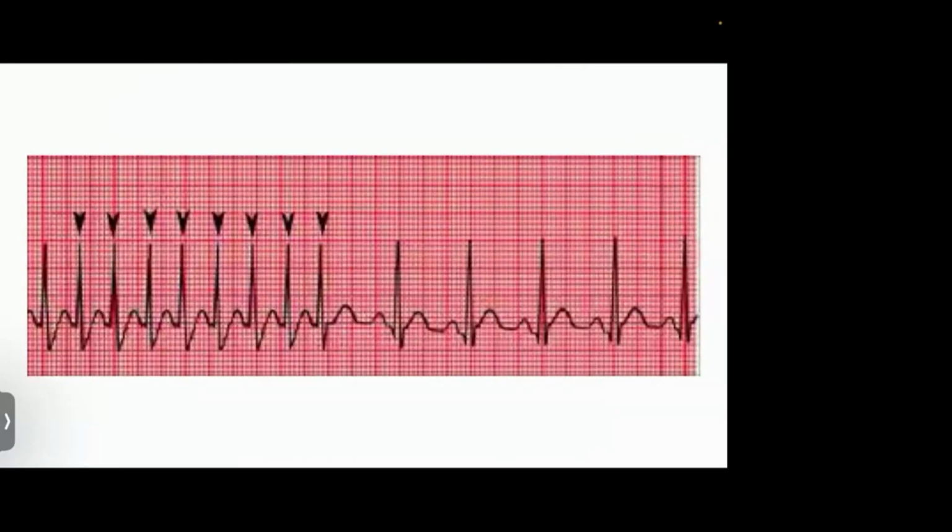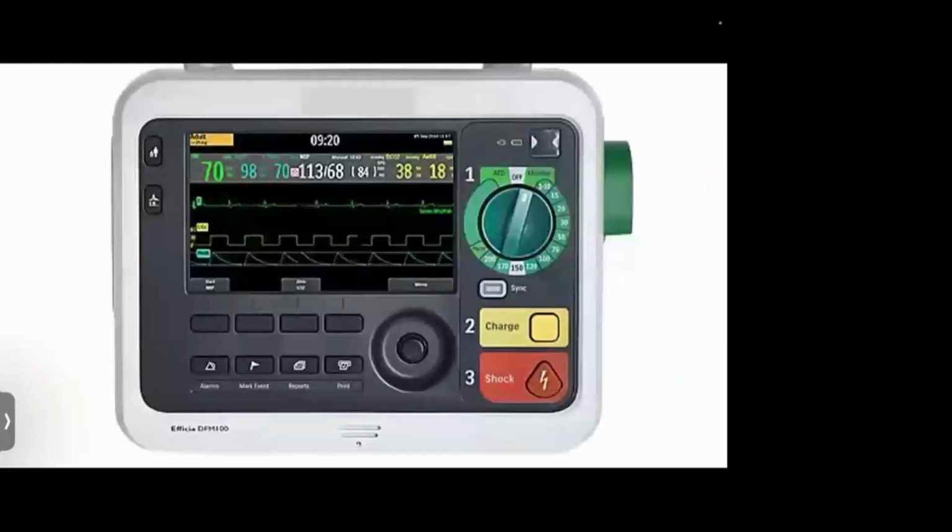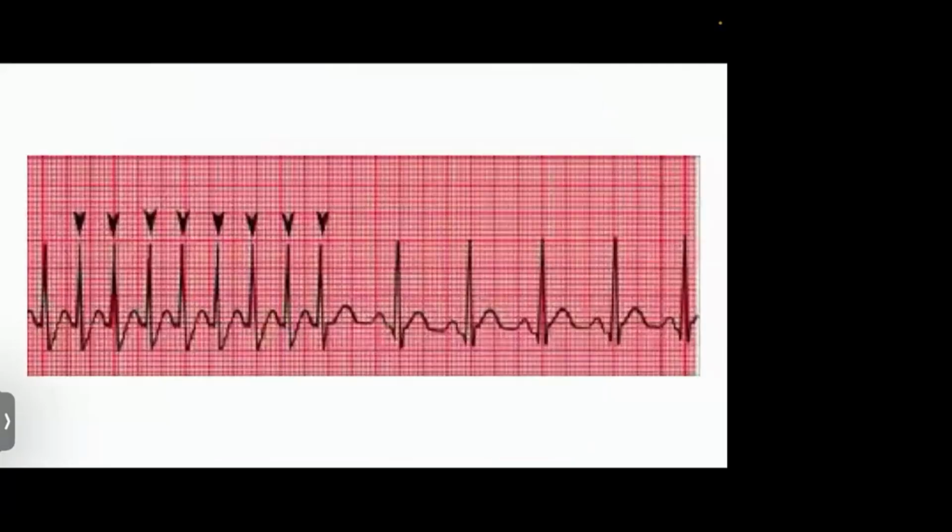So what happens in case of a synchronized cardioversion? You see the initial part of the ECG showing the abnormal waves. Now there are certain pointers given on the screen, and the pointers denote the R waves. So this is synchronized. Whenever you press the sync button, which is also on the screen, after attaching the ECG leads, it will analyze the rhythm and detect the R waves. The machine will deliver the shock whenever it synchronizes with the R waves. Otherwise, the machine will not be able to deliver the shock.